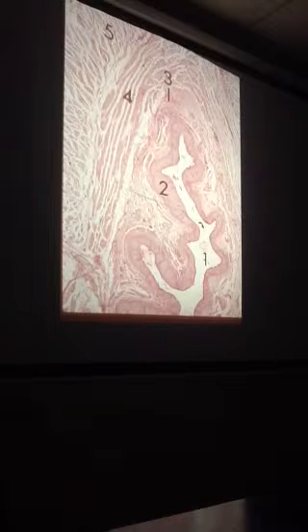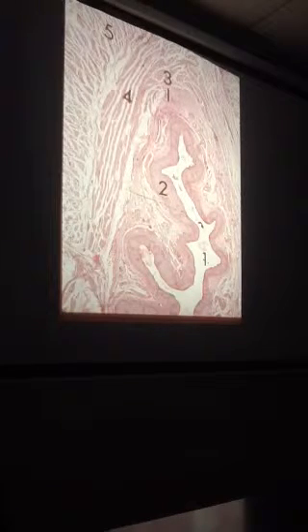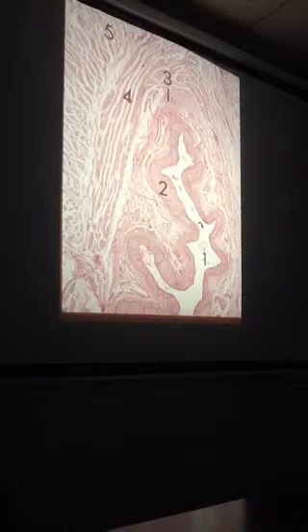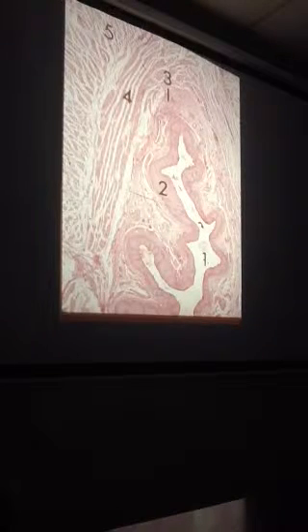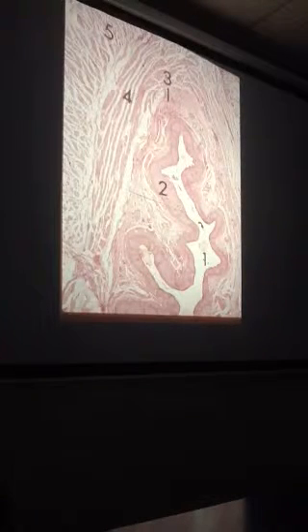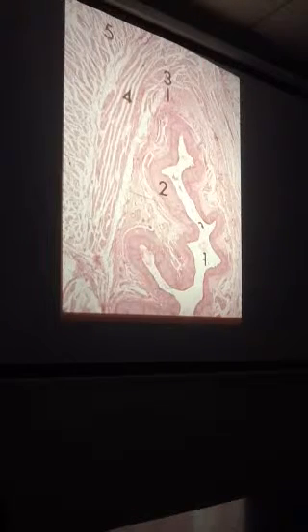And sometimes it's as important to see what's not there as what's there. Do you see villi? Mm-mm. Small intestines out. Do you see gastric pits and gastric glands? Nope. Stomach's out. Do you see crypts and goblet cells? Crypts with goblet cells? Nope. What's left? Yeah, this is esophagus, stratified squamous, and that's it. Stacked cells on the luminal surface, gotta be esophagus.